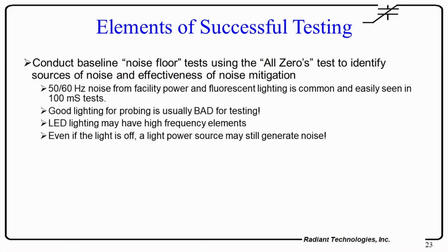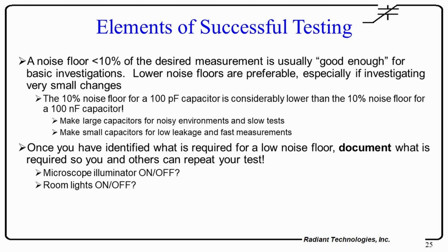On screen now are some final reminders and considerations for noise floor tests. Pause the video as needed to read all the information.